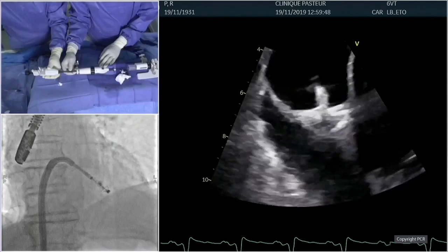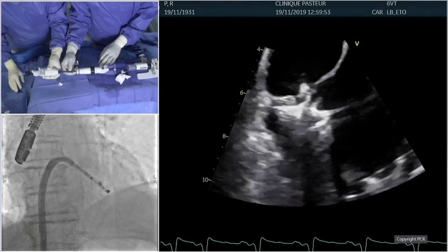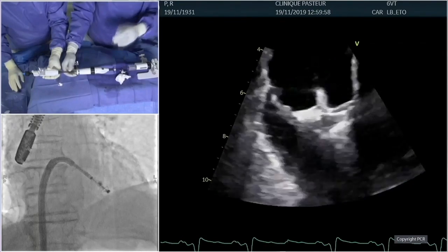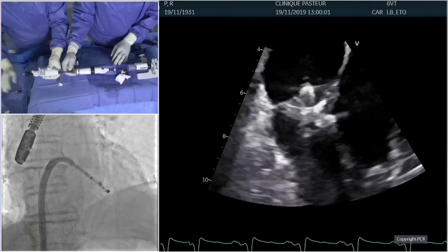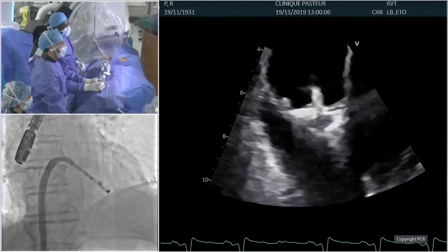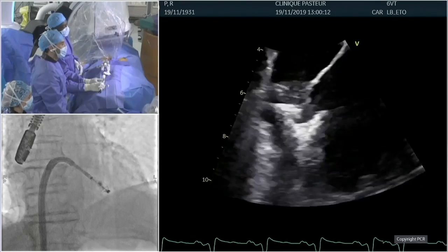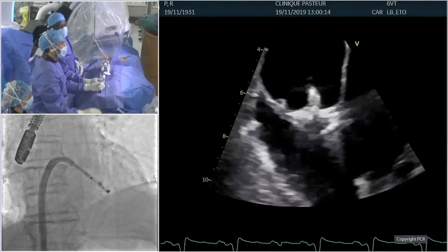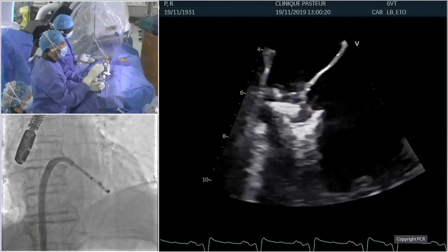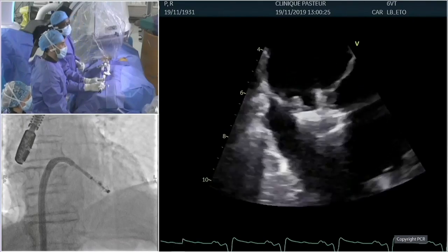And we saw that we had a kind of folding of a posterior leaflet at the time we had the clasp. Explain that for the audience, please, Nicolas, because it's quite important. This is something that we've learned with that device. If we now look at the image, we see that the anterior leaflet is inside the device, and we see the bouncing of the anterior clasp. But we saw that at the time of descending the posterior clasp, the posterior leaflet was kind of folded, curling, and finally was out of the device.